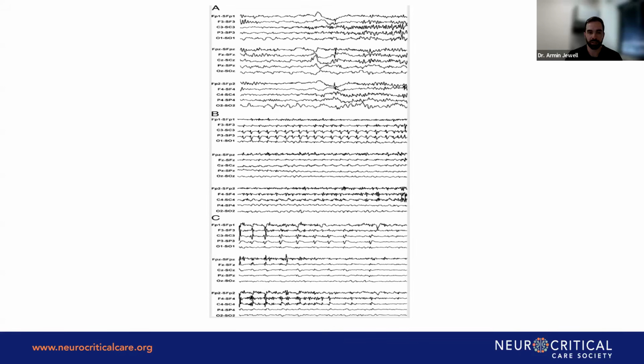They often also tended to base it on clinical suspicion. Parasagittal related seizures, for the most part, tend to often have motor symptoms related to them based on anatomy. So if there's clinical suspicion for motor related events that are seizures, they tended to say you should favor a full coverage EEG of some kind.